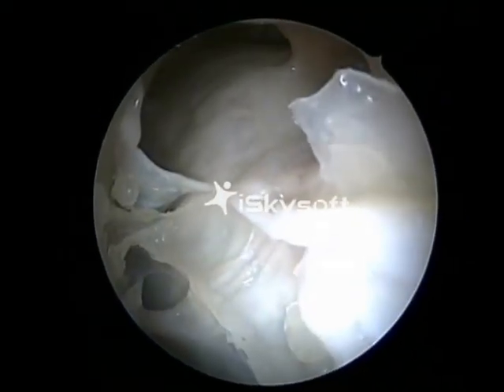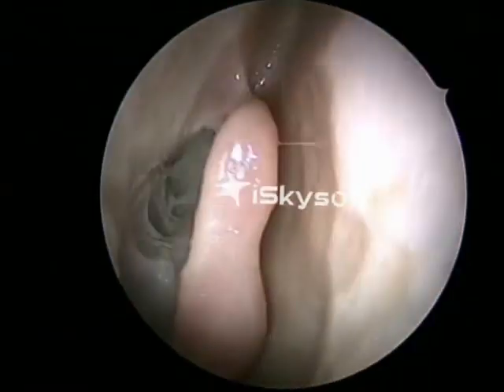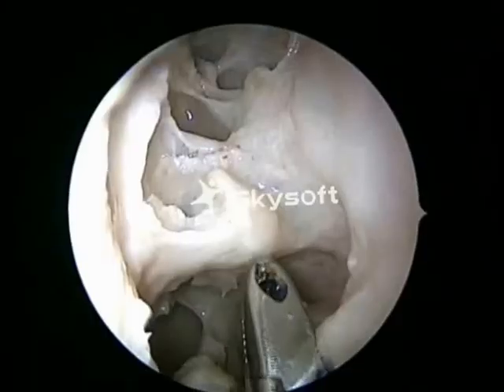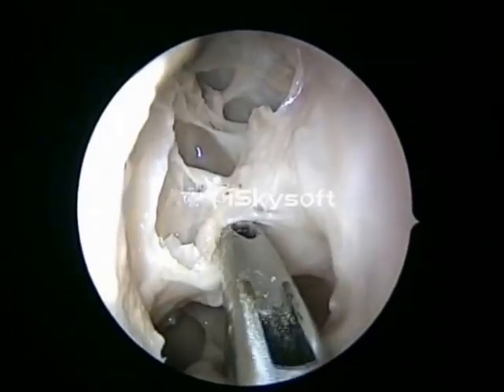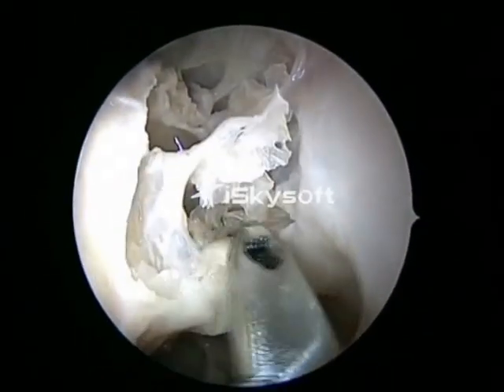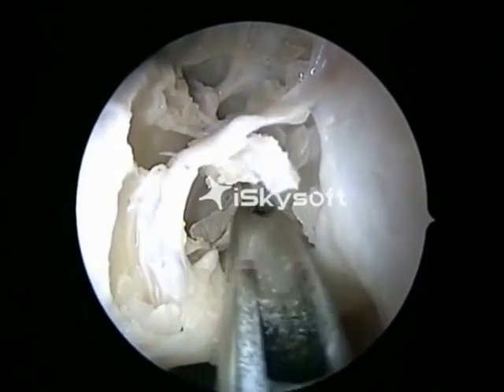The frontal recess is seen very well. The anterior portion of the fovea, the anterior ethmoidal neurovascular bundle, is seen very well. The next step would be to puncture the basal lamella. The basal lamella is punctured inferiorly and medially, and then the Blakeslee forceps is used to bluntly dissect the posterior ethmoid cells.